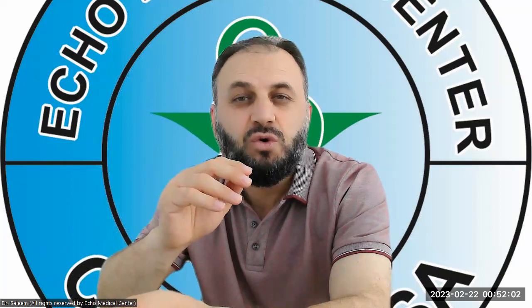But anyway, we start from the carotid artery. It doesn't matter right or left, it's not important. But for example, if you start from the right carotid artery, we take sagittal and transverse images, short axis and long axis. For the short axis or transverse images, we try to take the proximal, mid, and distal areas of the carotid artery to see if there is any plaque buildup, dilatation, or any pathology we can catch. So we take gray 2D imaging, and we also look at the color Doppler. If we can catch any of these, we just take those pictures.